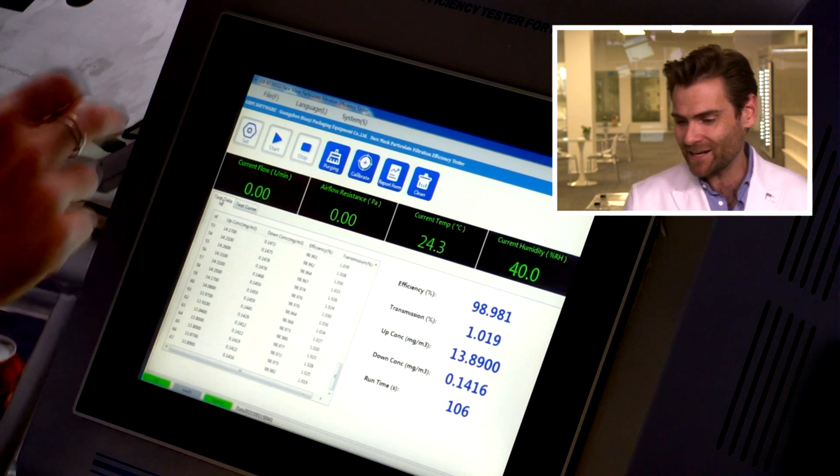98.981 — 98.981. Pretty good test. Let me open this up.